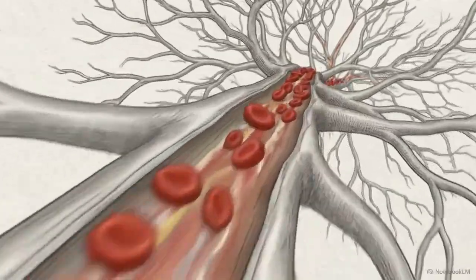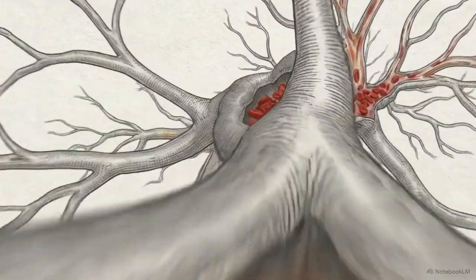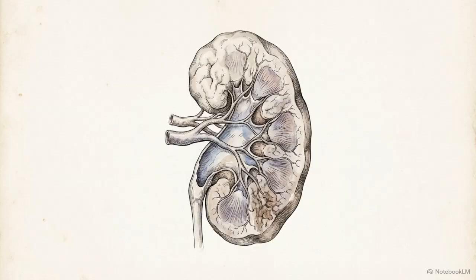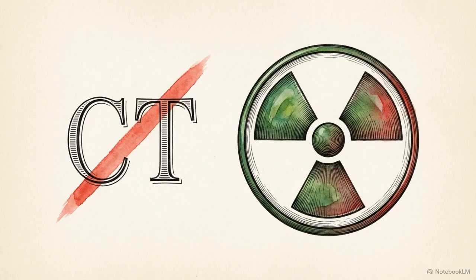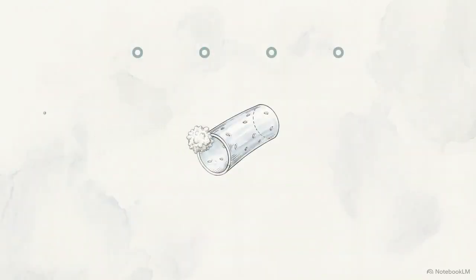When a patient needs to rule out a pulmonary embolism, a CT pulmonary angiogram is the standard choice. But if that patient has a severe contrast allergy or a very low glomerular filtration rate, CT is contraindicated, and we have to rely on nuclear imaging. Nuclear imaging relies on deploying targeted radioactive agents to exploit specific microscopic bottlenecks in human physiology.